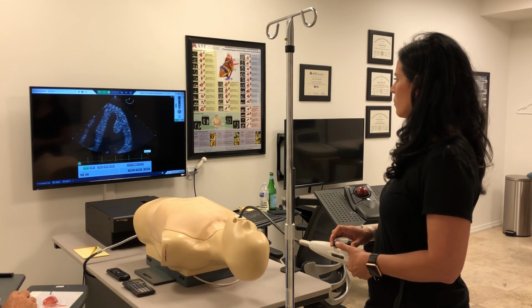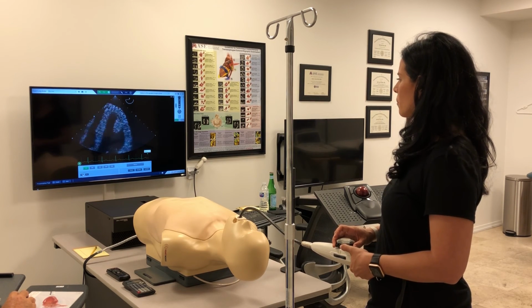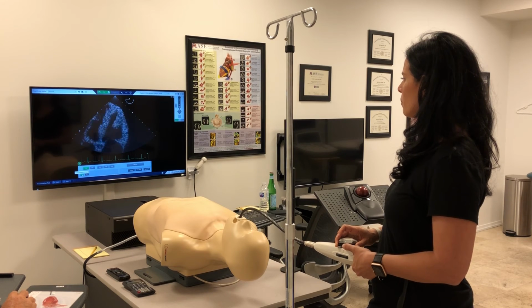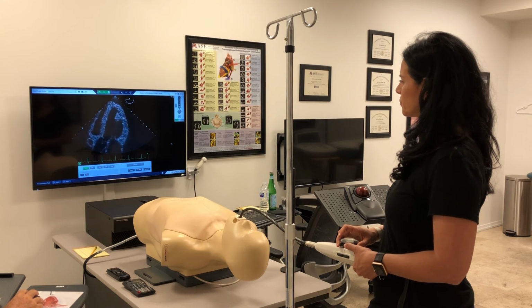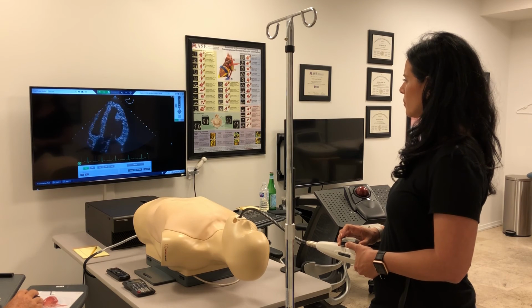And here comes the left ventricle. And I'll deepen the field a little bit. And we're trying to find that plane right here where we get a good clean Doppler shot at the LVOT and the aortic valve cusps for doing quantitation of either stroke volume or aortic valve areas. Good, very nice. Okay, now let's progress on to our aortic pullout.